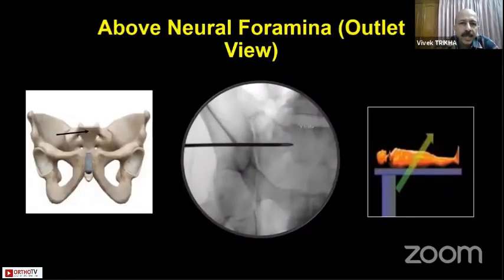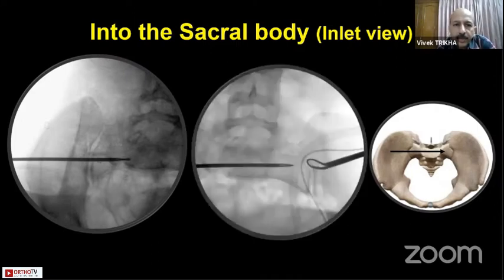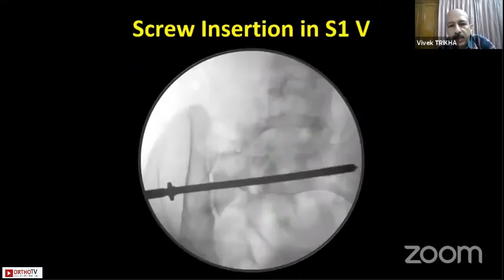Once you confirm placement on the lateral view, go in for an outlet view and verify that you are going above the S1 neural foramina — the drill going like an eyebrow or eyelashes to the eye of the neural foramina. Then on the inlet view, confirm you are inside the sacrum and not going anterior to it or posterior into the sacral canal, thus preventing damage to vital organs. Then advance the drill guide to the opposite side and put in your screw.